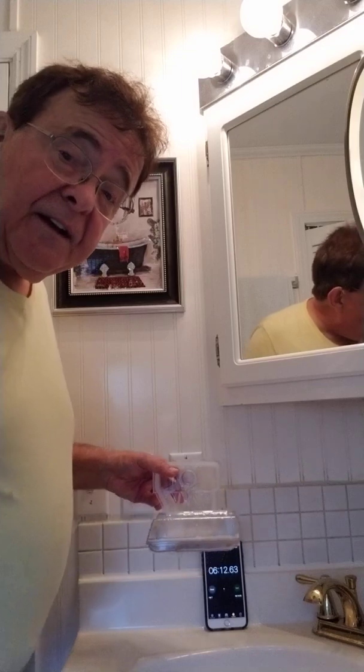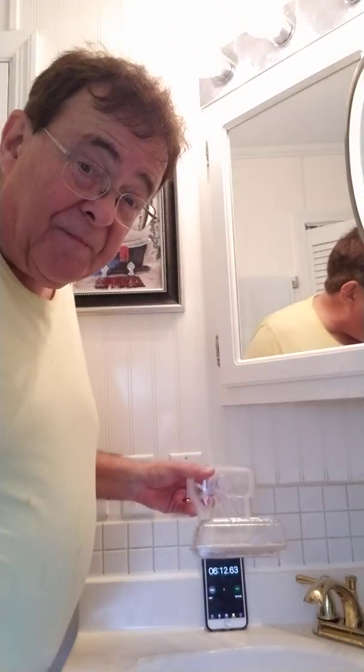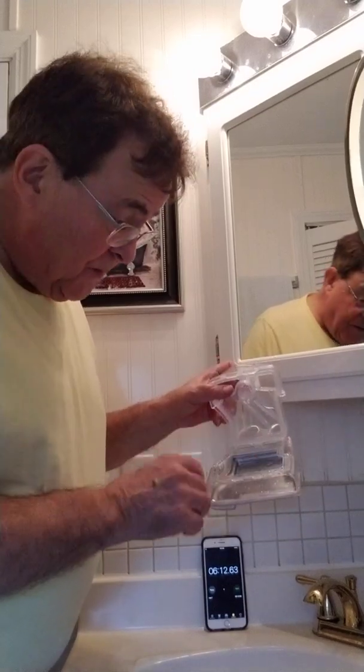And I double checked the ResMed, and even when it's time to fill up this tank, they suggest using distilled water, but they said it's completely fine to use bottled water or tap water. Now, here in the U.S., I would say I'd rather use tap water because, again, having done a lot of projects in water and wastewater plants, I know what they go through to ensure safe water. So the biggest concern they have is buildup of deposits in their pan.